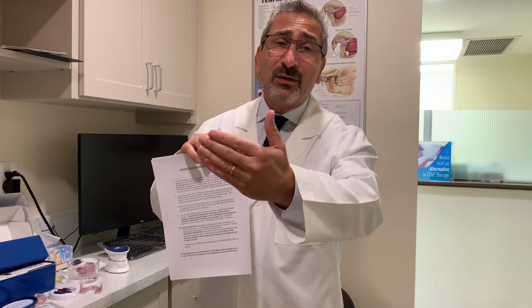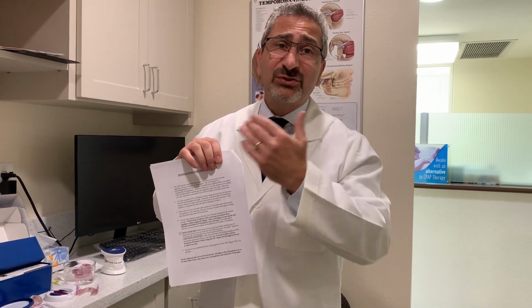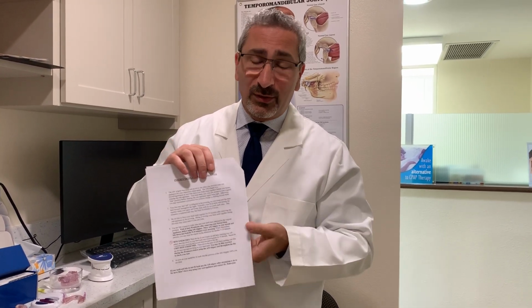If you adjust your mouthpiece where it stretches the jaw out too much, you may have problems getting your teeth back together, and you may need to stop wearing the mouthpiece for a little bit until the bite settles back into place. It's very important to do these exercises to keep your bite where it is.